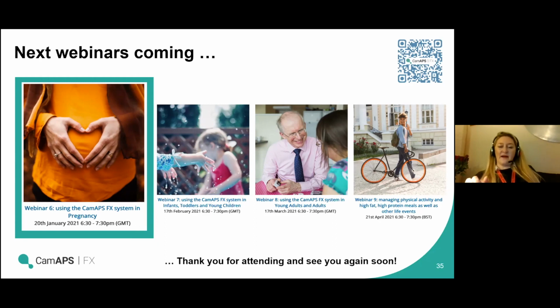But if you've got that, which is left over from a previous version, the way to get rid of it is if you go to your alerts, you check what you've got them all on initially, so you can go and put them back in, and then restore them to factory alerts or something like that. Reset alerts, yeah. Reset them and then put them back, and it will ditch the crying baby, which I don't know how that even happened. Terrible one to be coming out, wasn't it? Awful. Yeah.